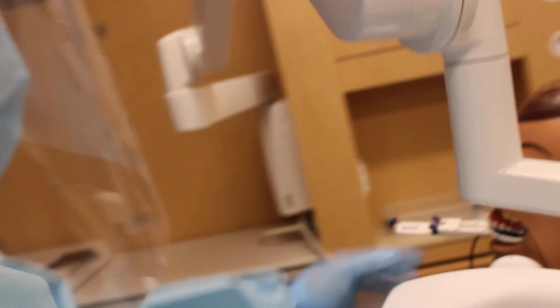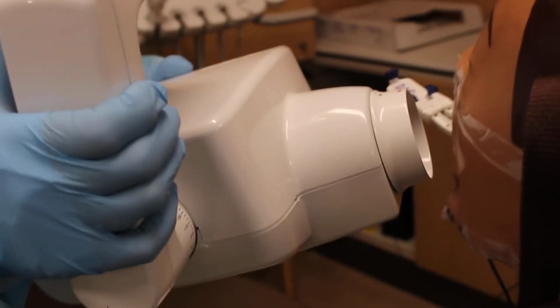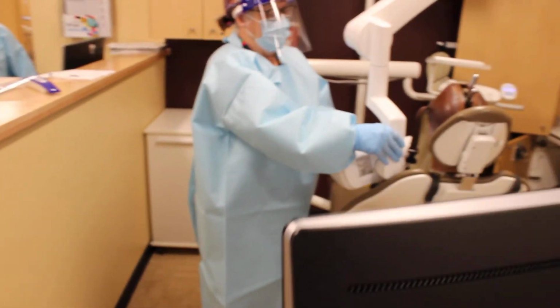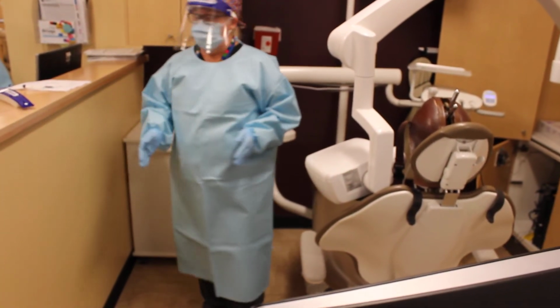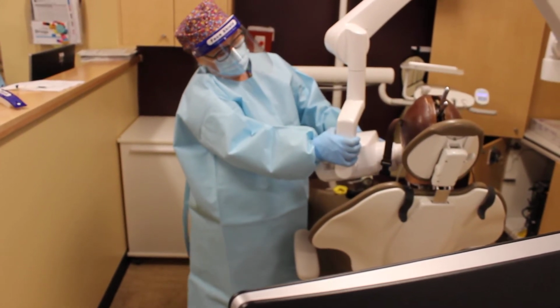Now when we're talking about the horizontal angulation, you're looking so that the central ray goes right in between the contacts. So if I were to do it like this, I would still hit the dot, but would that get the overlapping? Yes. If I were to go like so, it would give me overlapping. So you're trying to go right in between the contacts. So I'm going to point it at the dot, trying to make sure that it goes right in between the contacts.